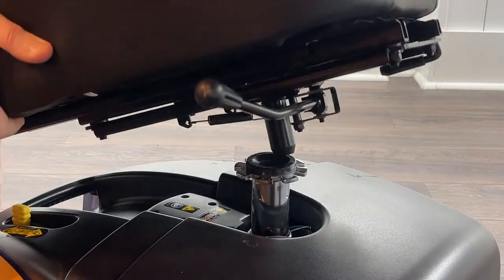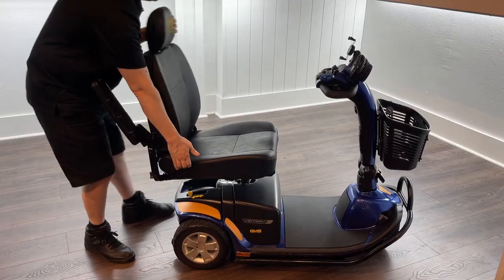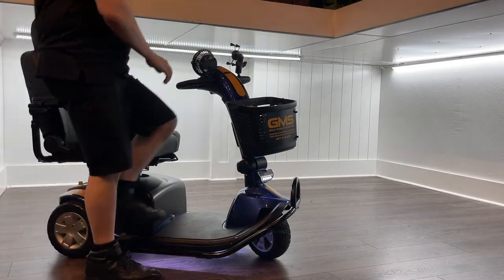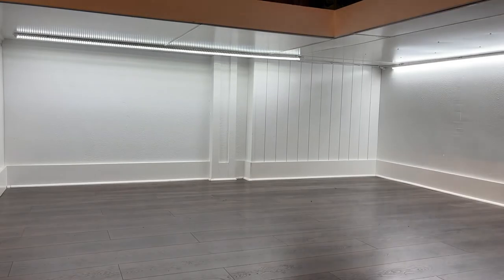Step four is to replace the chair by lining it up on its post and returning the seat upright. Your Pride Victory Mobility Scooter is now ready for use. Take care of it and it'll take care of you.